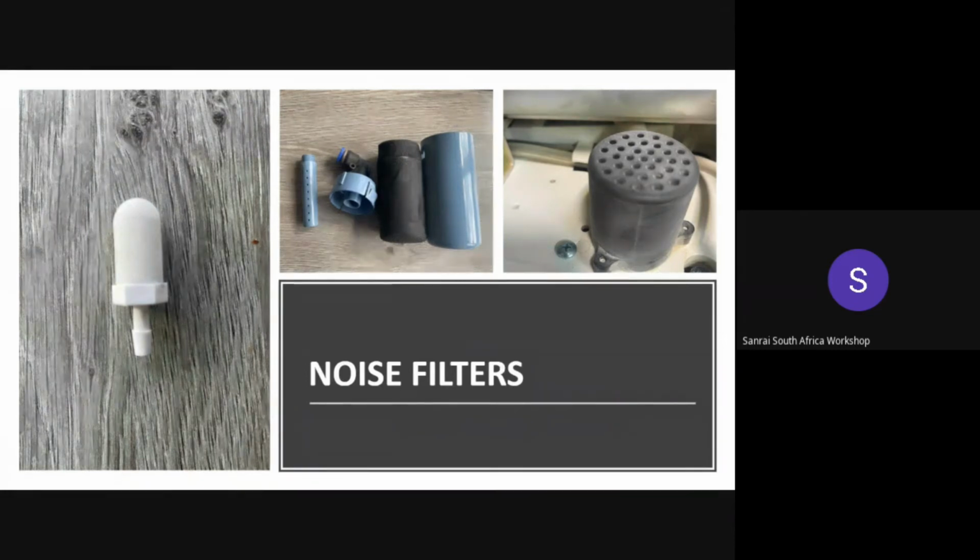The filters that they are responsible for, they would need to take care of them, as that decreases the requirements for service. If these are taken care of, then the machine will only need major services.